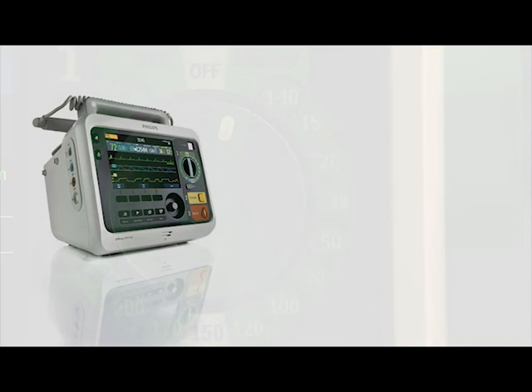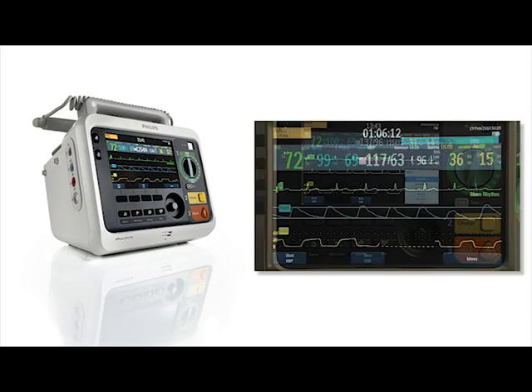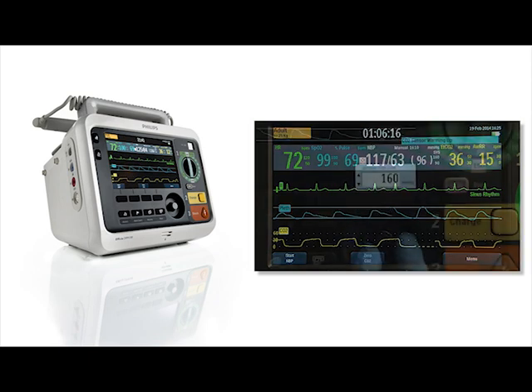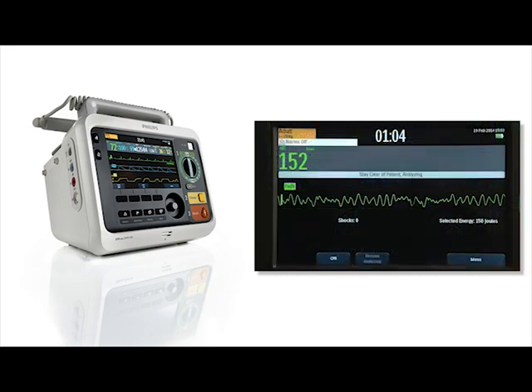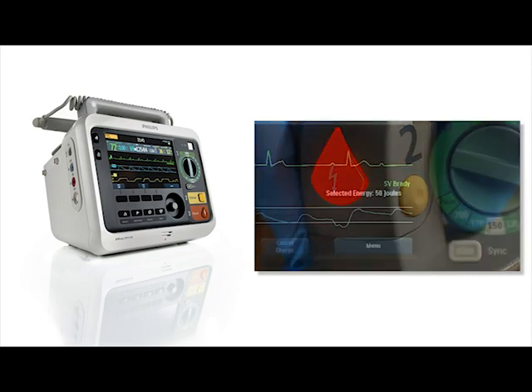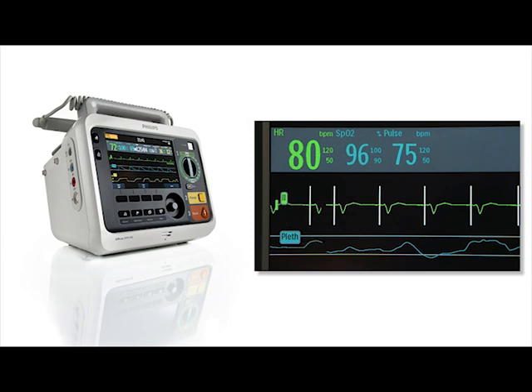This completes our program on the Efficia DFM100. We've covered an overview of the device's features and controls, explained how to monitor ECG, SpO2, NBP, and EtCO2, manage alarms, and display trending data, and demonstrated AED and manual defibrillation, sync cardioversion, and pacing therapy.